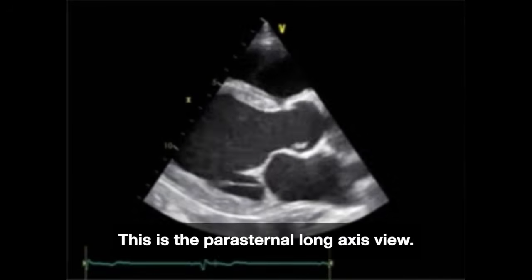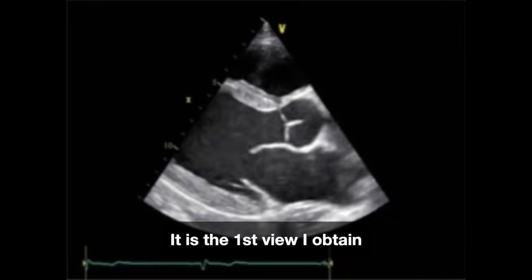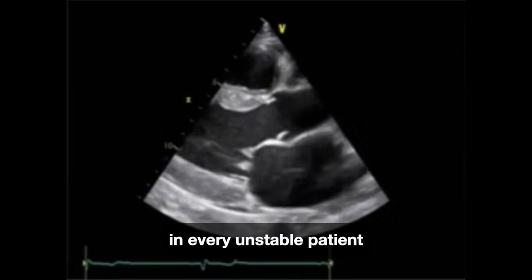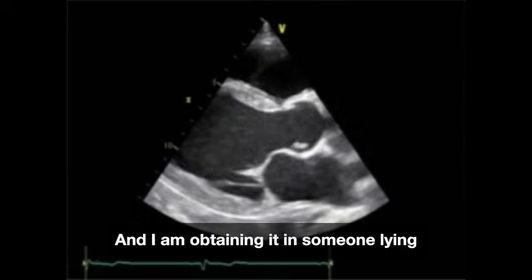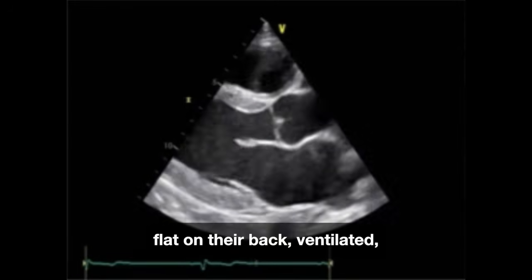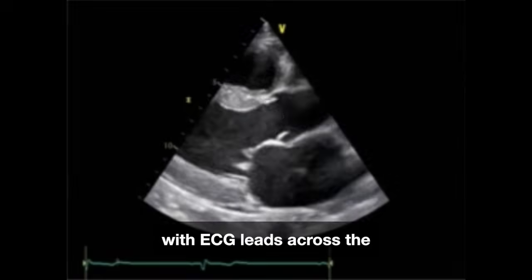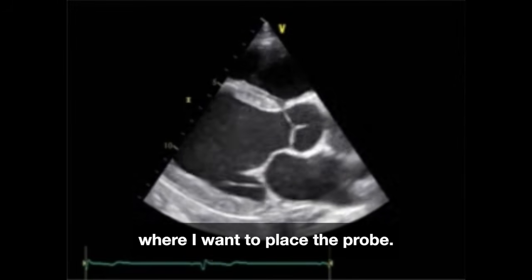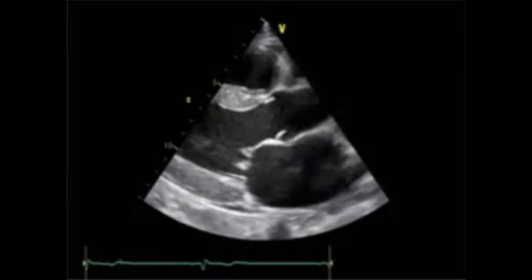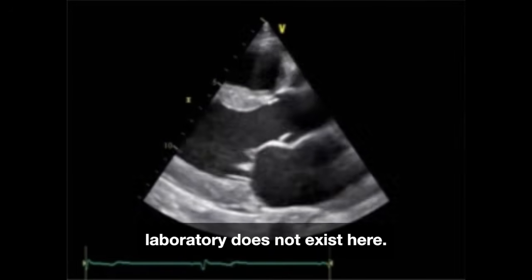This is the parasternal long axis view. It is the first view I obtain in every unstable patient in my ICU. And I am obtaining it in someone lying flat on their back, ventilated, with ECG leads across the chest and addressing exactly where I want to place the probe. The position they teach you in the echo laboratory does not exist here.